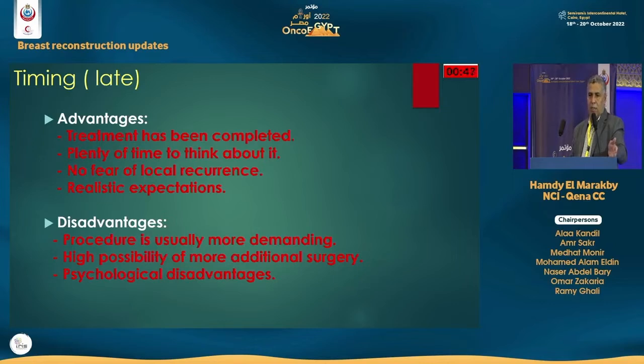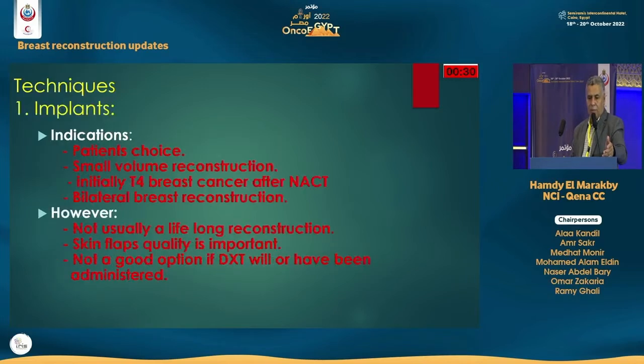Again, with the tissue expander, with an implant expander that you put immediately after MRM, the patient will think that something is getting done, and she is in due course, and she is on the line of further management, particularly with the reconstruction. We talked about the implant.